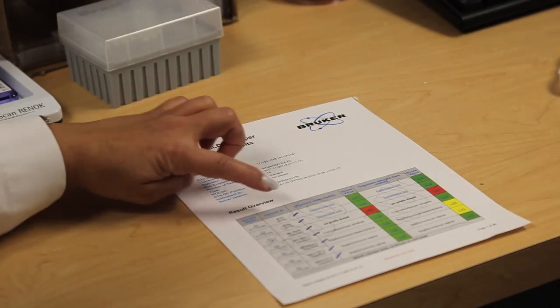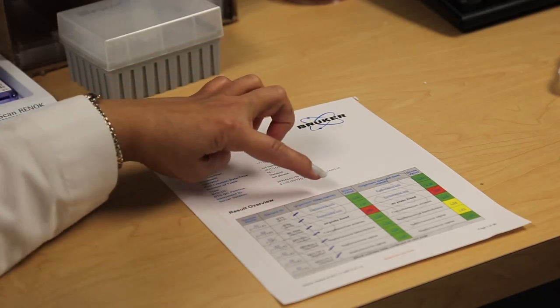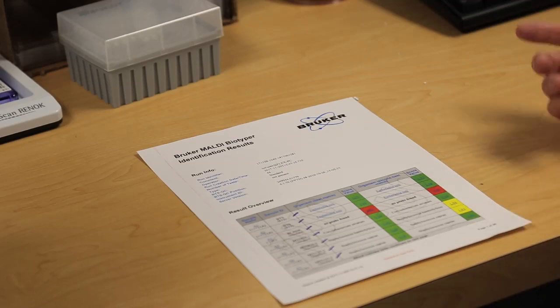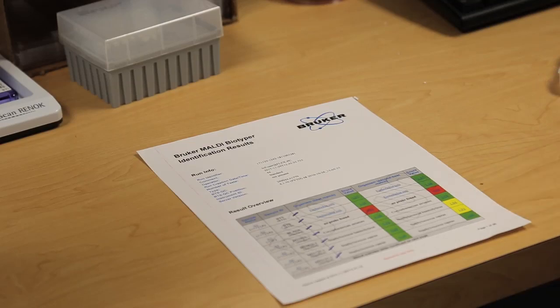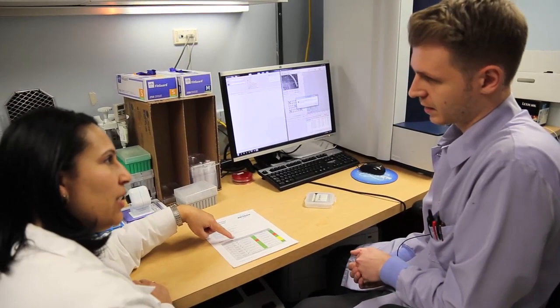Okay. So, for example, this top one, A1, whatever that sample is, it's growing E. coli. Exactly. That's confirmed. Is this a confirmatory on this? There are 2. Yeah, so it'll give us the top 2 scores, and essentially how it breaks down is anything that is underlined means there's something that's preventing it from getting us the ID to the species. So, for example, with E. coli, as we know, it's closely related to Shigella. And they're so closely related that we can't tell the difference on MALDI, so we have to back it up with a few biochemical tests to confirm that. Okay. So we use indole. Okay, so this is E. coli or Shigella on MALDI.